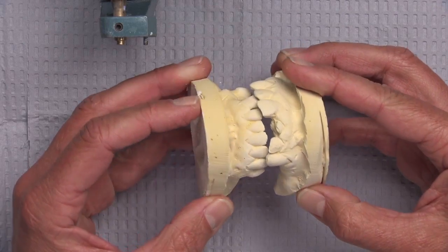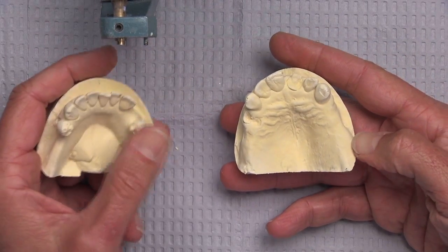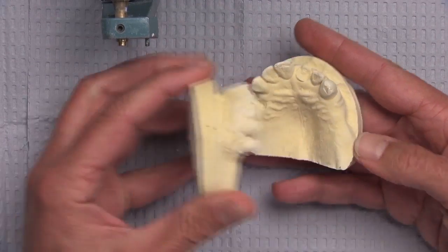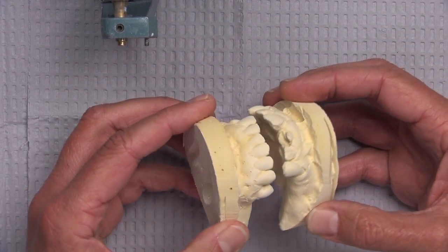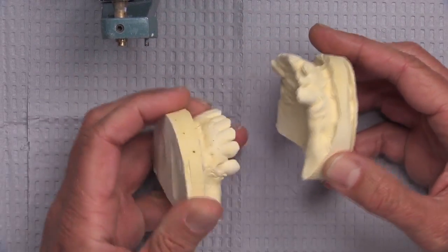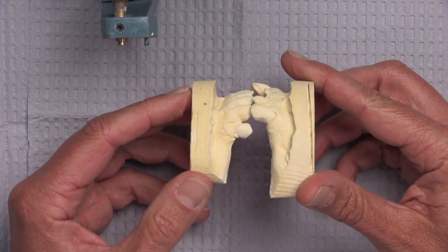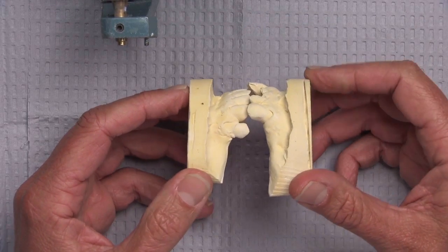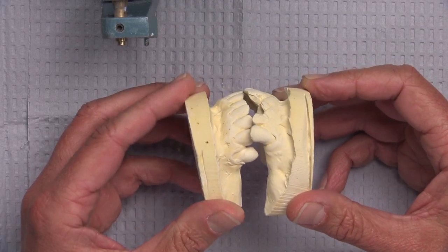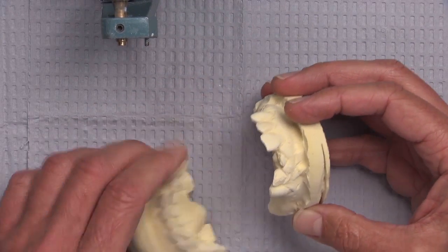I know it's asking a lot to do a bite block for a case like this — I doubt you would order a bite block in advance and have the patient bite into it for posterior support. But another way to do it is just with a mush bite, or even just mix some impression putty and have the patient bite into it on their edentulous ridges. It's far from perfect, but at least it gives us an idea if we're on the right track when we go to hand articulate it. We were able to articulate these two together.